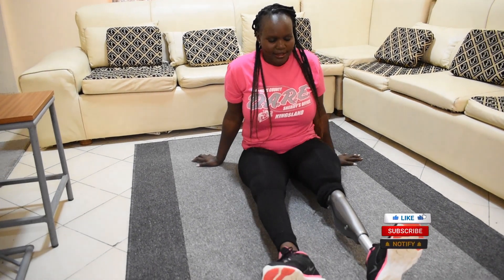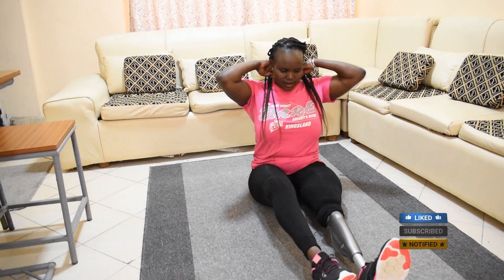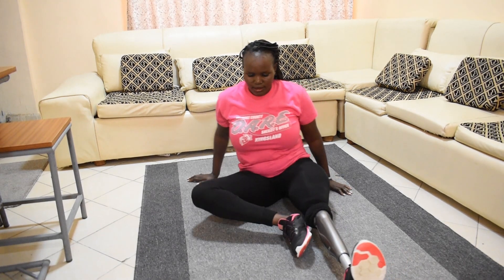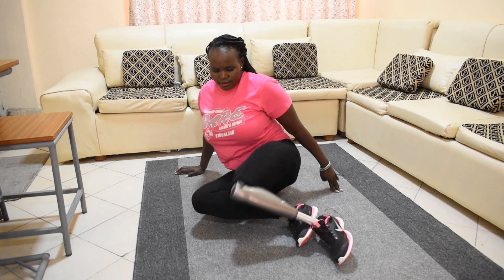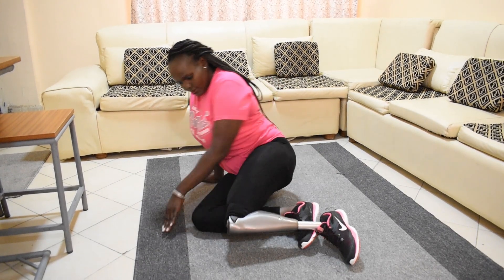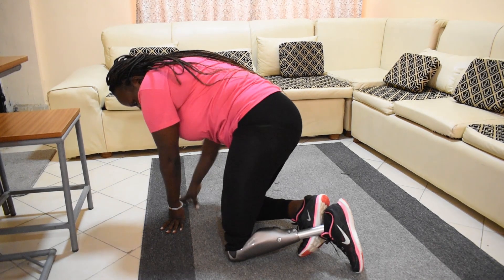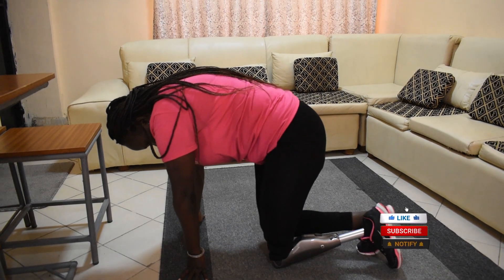Someone asked me: how do you usually fall? Does it hurt? Is it painful? Answering this — in most cases, I usually find myself falling on the side of the prosthetic leg. It's safe and doesn't hurt, especially when I let myself fall.